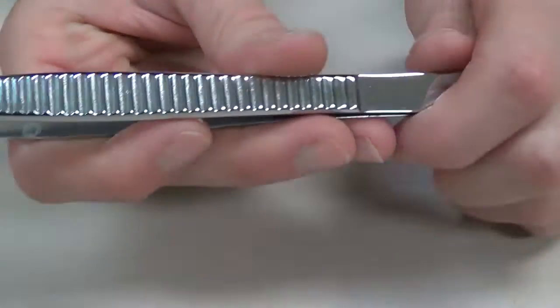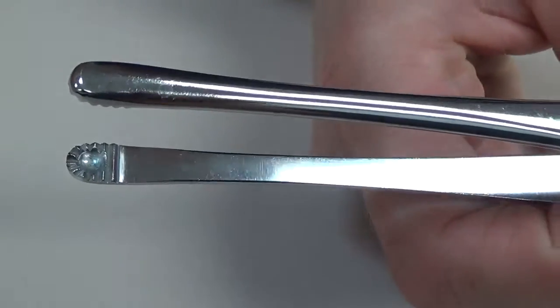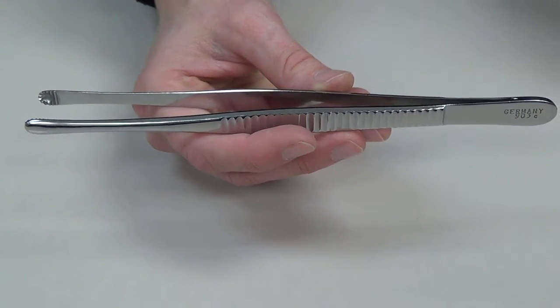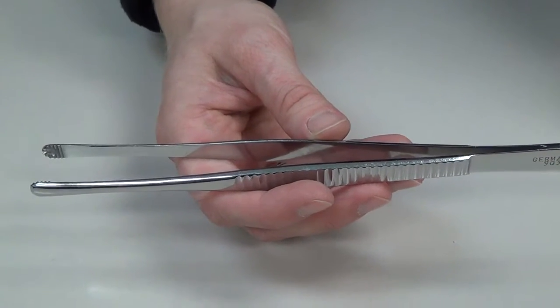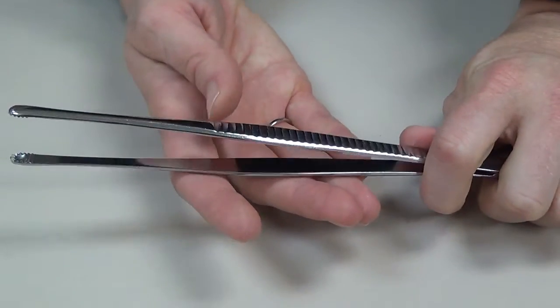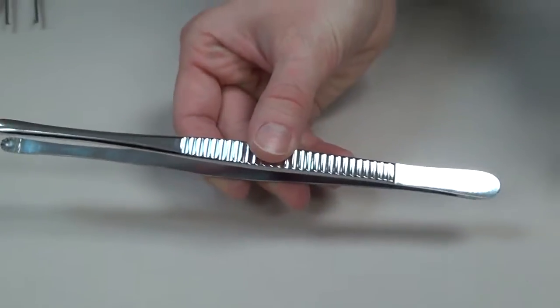Another atraumatic forcep very commonly utilized by GYN surgeons is what we refer to as a Russian forcep. You can see the cup in the tip and there are no teeth — it's atraumatic. It can be utilized on the peritoneal layer and inside the abdomen similarly to the DeBakey, but OB-GYN surgeons tend to prefer it. It comes in multiple lengths and can be used deep inside the wound. Orthopedic surgeons also use it to pick up bone graft because the cup at the end makes it easy to carry those pieces of tissue.